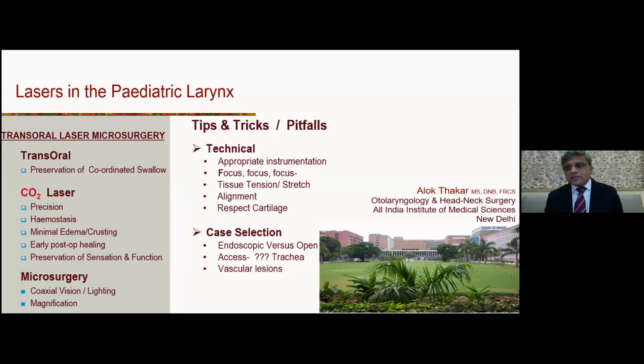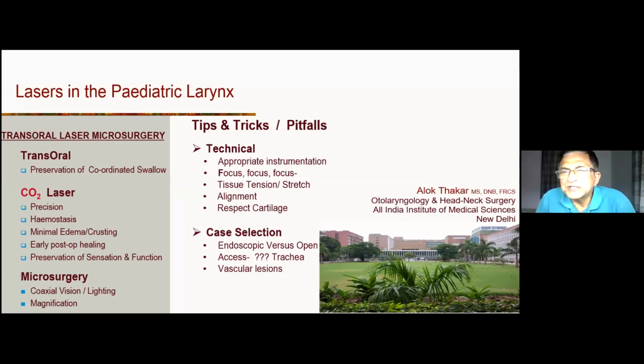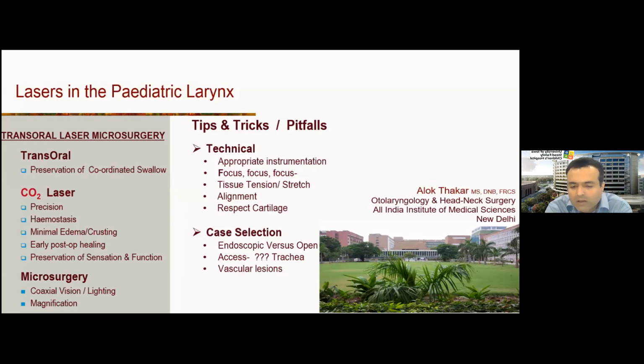Yes, absolutely. Thank you. Wonderful comments. Great point about subglottic hemangiomas. One of the things when you're using laser for subglottic hemangiomas, if it's a full circumferential subglottic hemangioma, is that you don't want to laser the whole subglottis and create subglottic stenosis. So what you end up doing is doing half a side first and then letting it heal and doing the other side, if at all a laser is needed for subglottic hemangiomas.